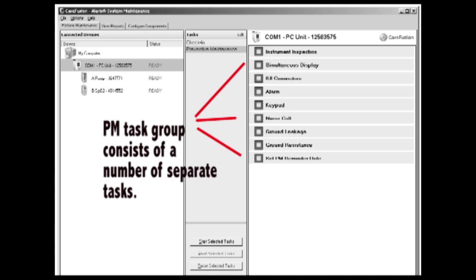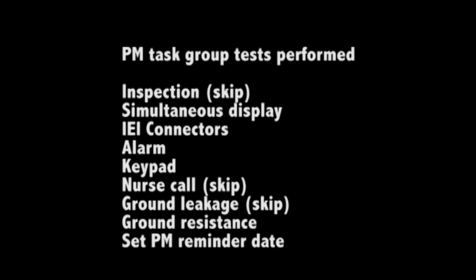As you can see the task group consists of a number of subtasks which are run in sequence. Today we will look at most of these. We will skip a couple and just concentrate on the main ones.